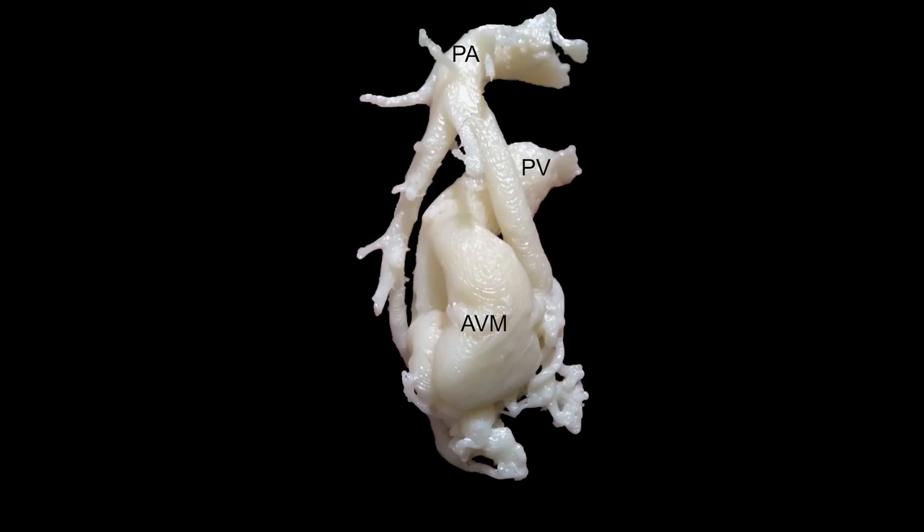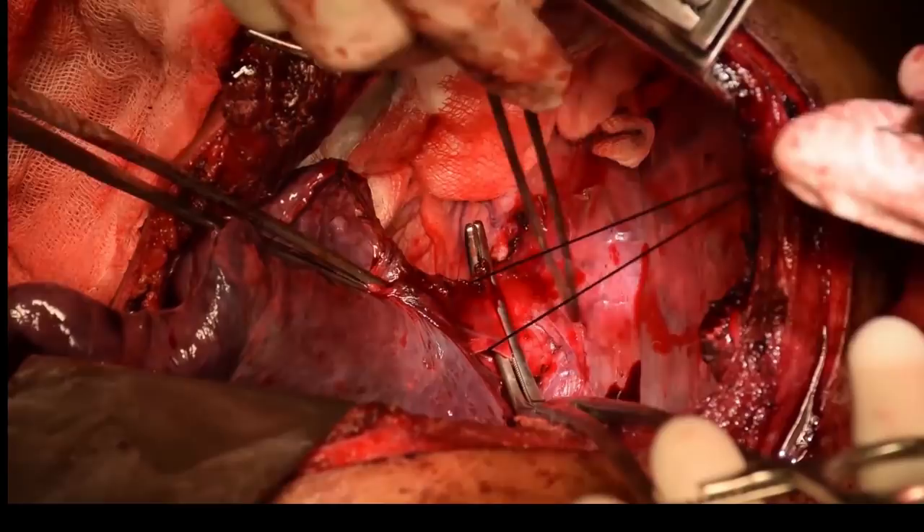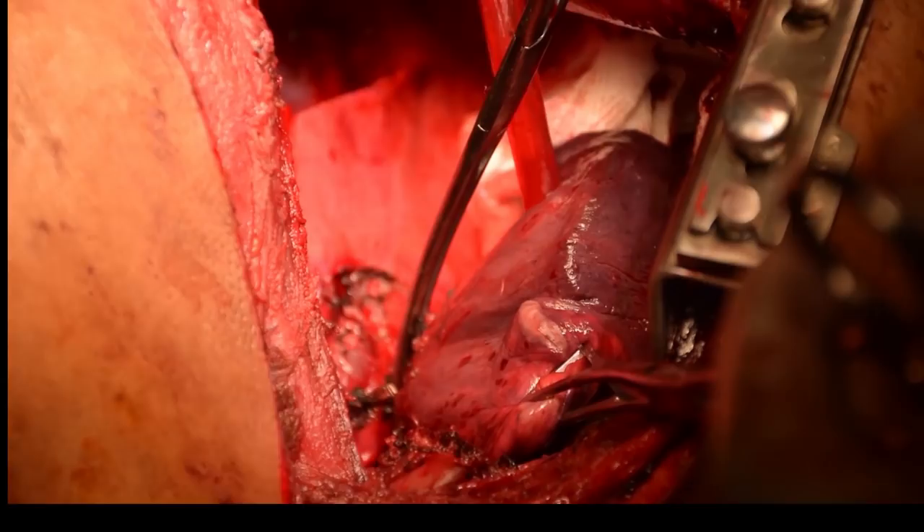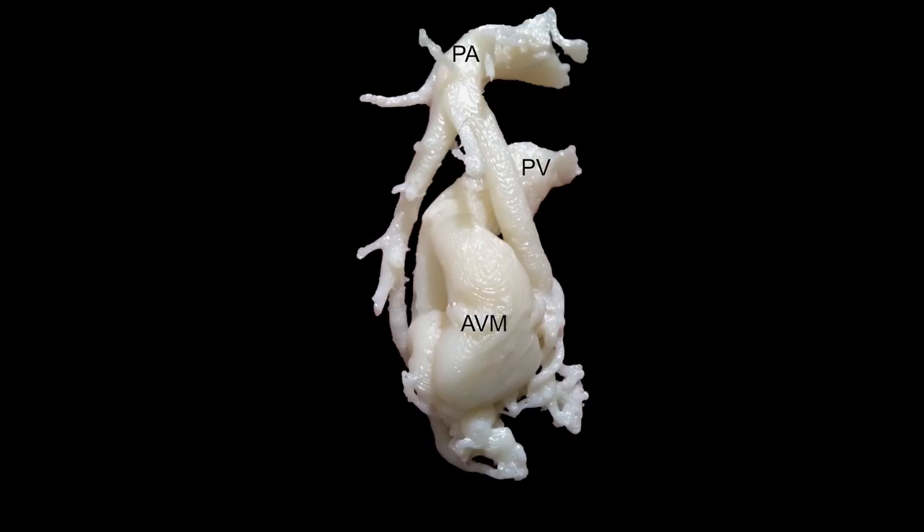Throughout the procedure, we continued to refer to the 3D print, which gave us an ongoing understanding of exactly what was happening. We could see through the tissues and through the blood because the print was available to us.